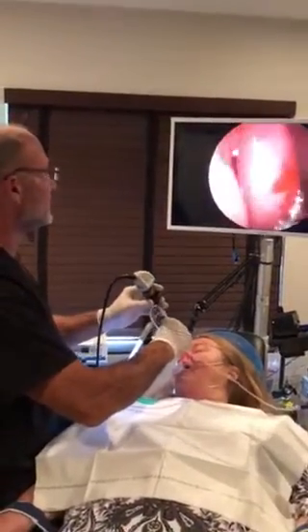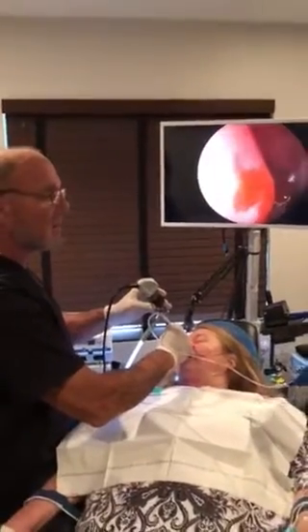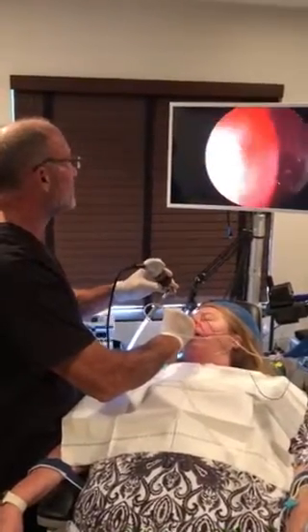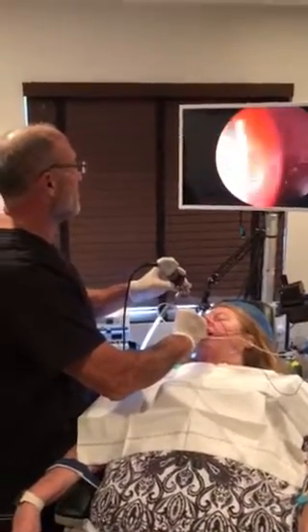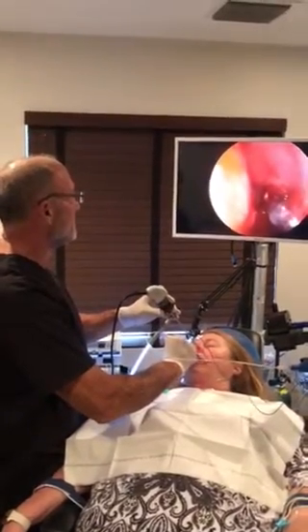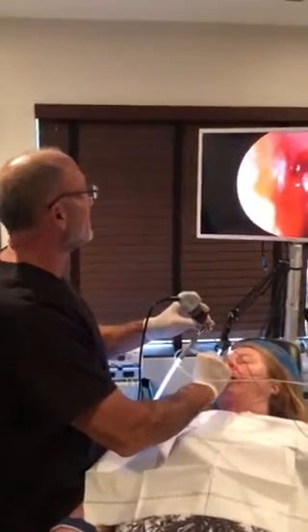It gives us extra comfort and safety, and we are going to be opening up this young lady's maxillary sinus with our balloon. It's in her left sinus now. Michelle, inflate the balloon. And as you see, our patient is very comfortable, having a very good experience.